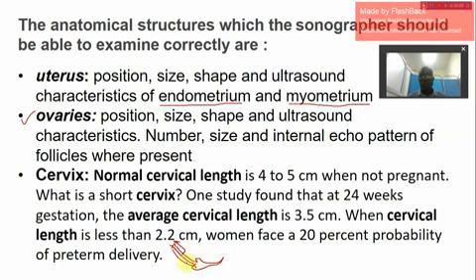So when it is short, the baby will like to come out, especially when it is cephalic and the head is fixed in the internal os. So here is the internal os, here is the external os.